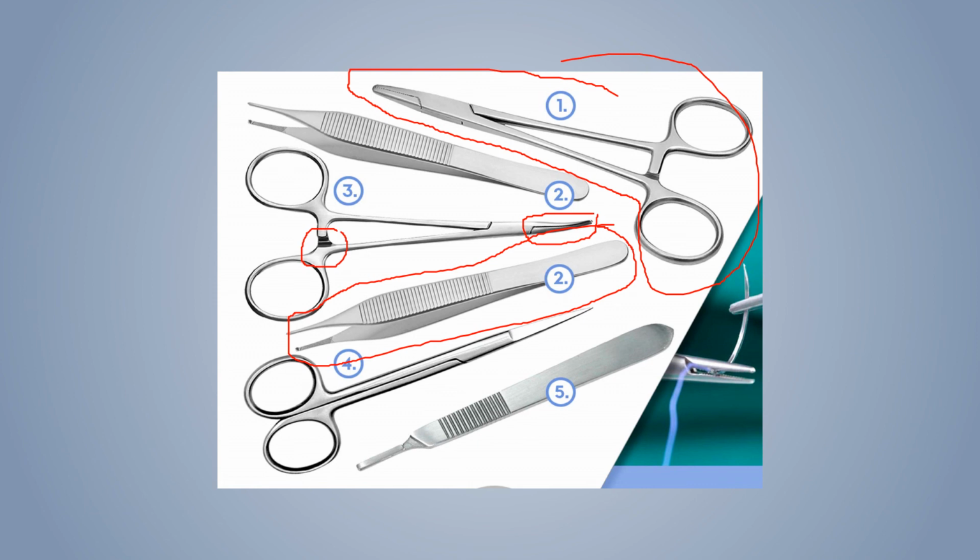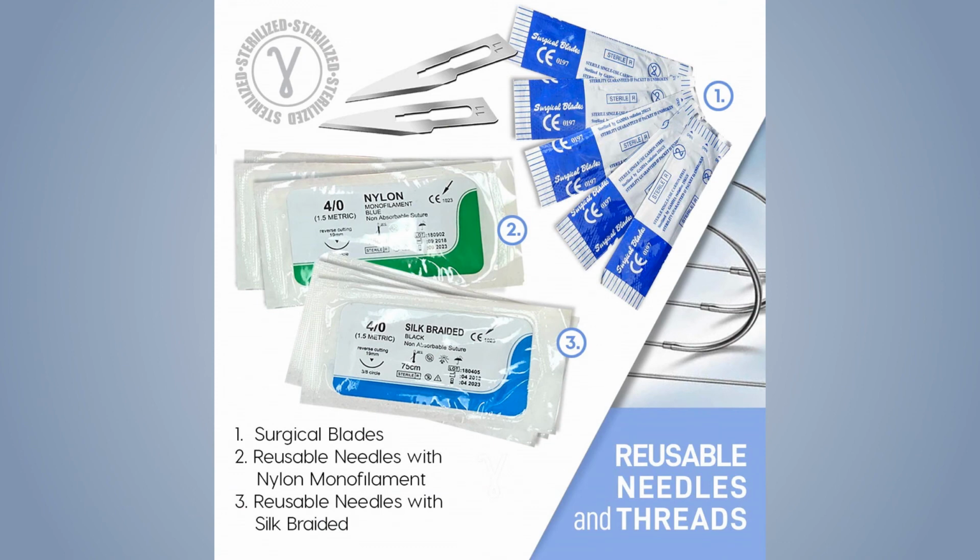Four, it will be your iris scissors. These are the nice straight scissors here, nice and sharp. And five is your scalpel knife holder, which we won't be using this one at all right now. You can use either the 4.0 nylon or the 4.0 silk braided. Again, you can reuse these and you can order more if you feel like you need more practice. Again, easy to find on Amazon. You may even talk to your clinic and see if they have any that have expired.